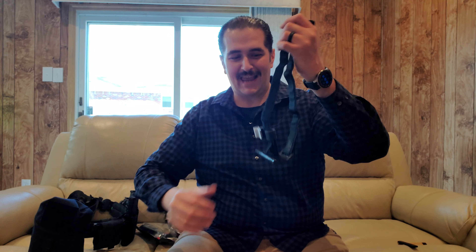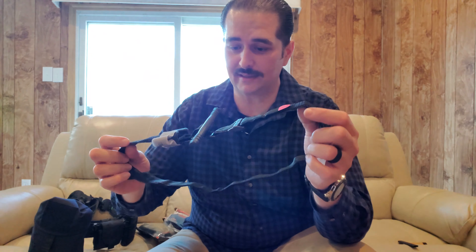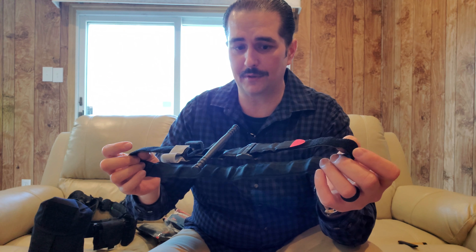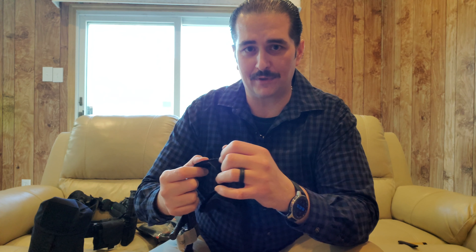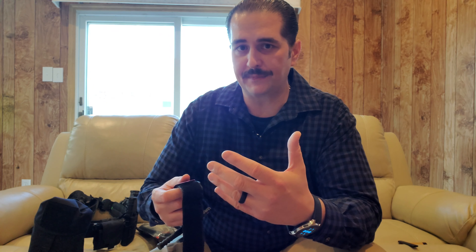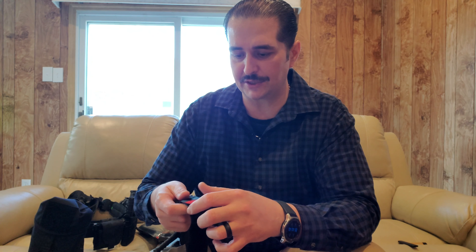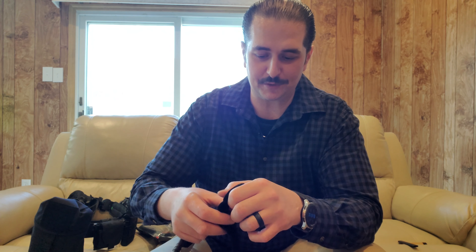This is actually take two, so I already took it out, but I keep one on my Minuteman bag — slash bump-in-the-night bag — right here in this tourniquet holder. Since this is take two, I already have it out. There are lots of ways to stage this, and for those of you that don't know, staging means how you fold it up and keep it ready to be deployed when you need it.